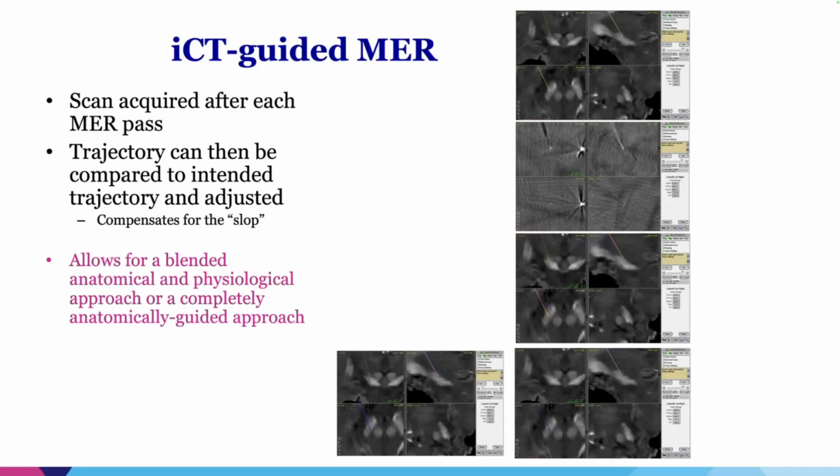I use a system where I still use a microelectrode as a targeting tool. If you just drive a DBS electrode home, you're really committed to at least a 1.5 to 2 millimeter adjustment if you're not happy with the trajectory. A microelectrode placement prior to deploying the electrode gives you a finer ability to make adjustments, rather than drastic ones like 1.5 to 2.